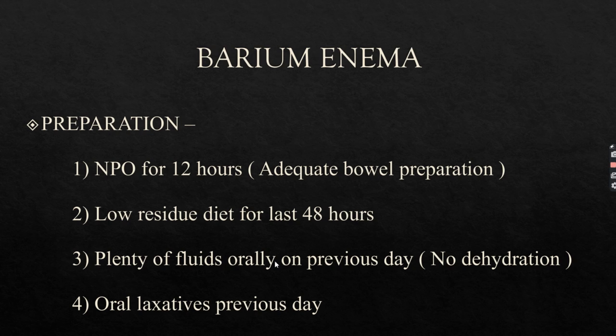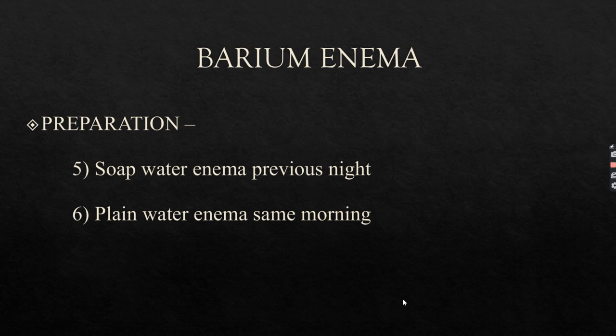Then plenty of fluids orally should be given on the previous day to prevent dehydration, and an oral laxative should also be given on the previous day for this study, barium enema. Soap water enema the previous night, and in the morning of the study day, plain water enema should be given, right?